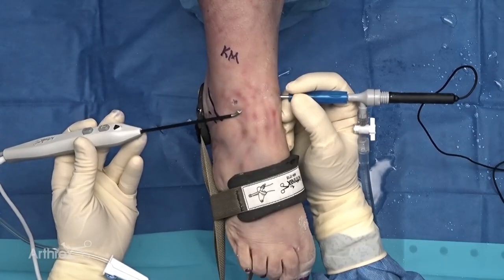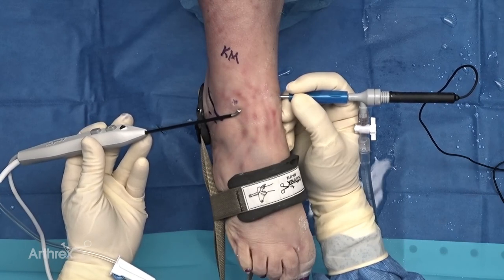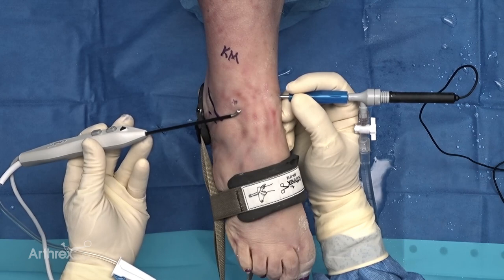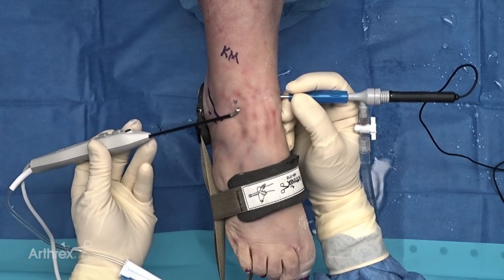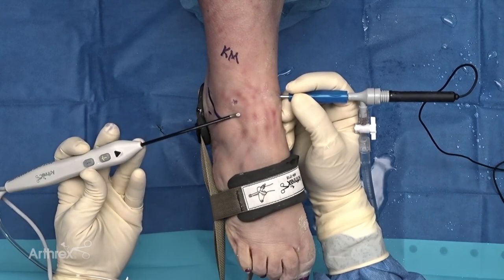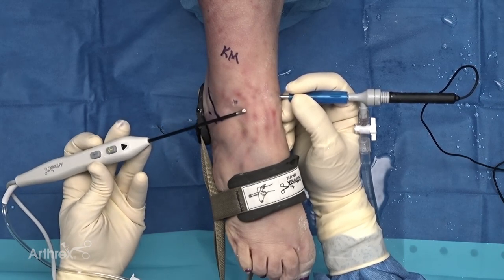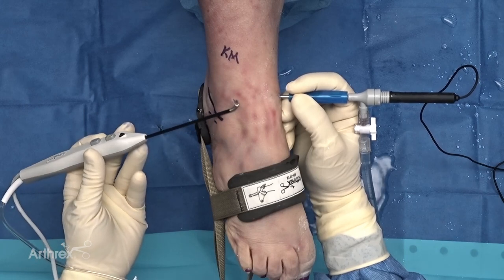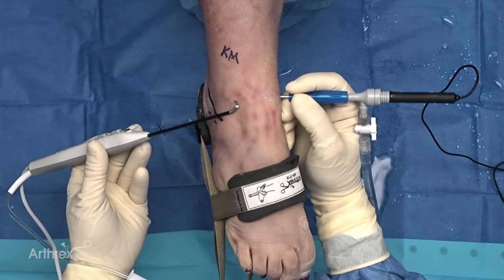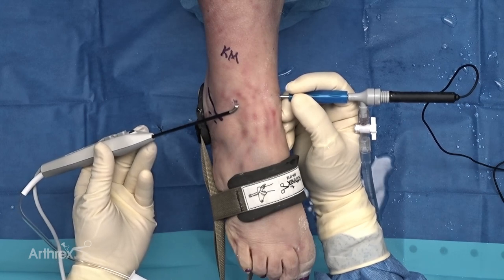Now let's talk about the SJ50. The SJ50 is really nice in the nano profile because it's 3.3 millimeters, which complements the small size of the nano. Looking at the probe tip, it also has edge cutting, which gives the surgeon good control near soft tissues and better control of the cut than other ablators. It also has suction, which prevents the intra-joint bubbles that can oftentimes obscure the view.